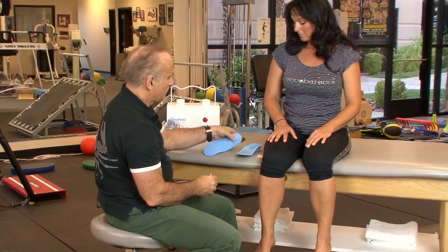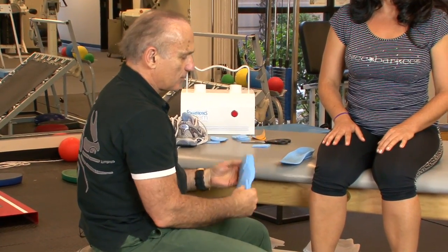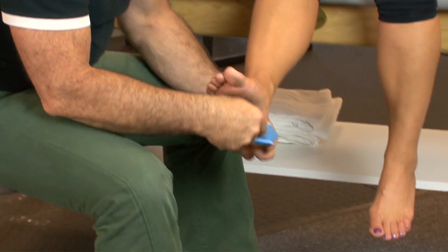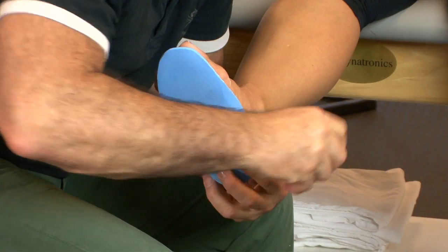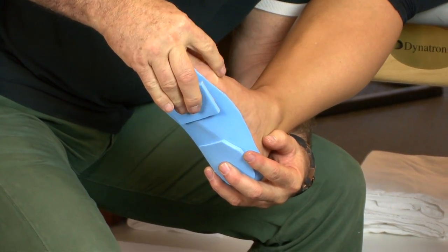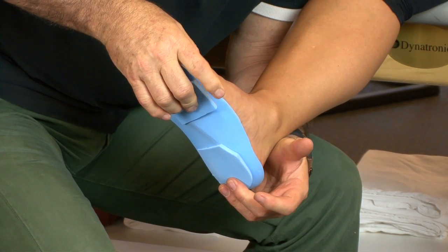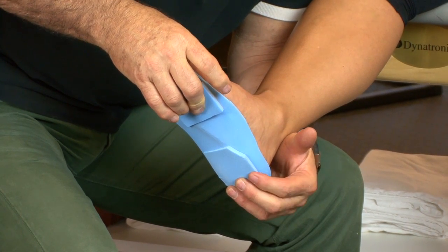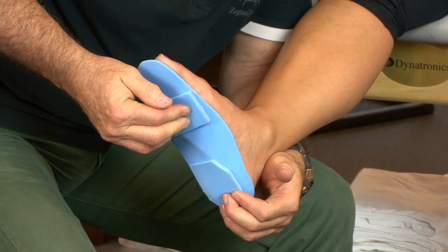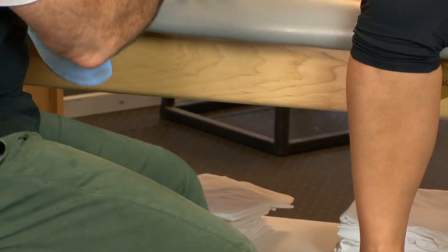I want to do a varus wedge in the forefoot — a medial post — just like the rear foot. I want it positioned right underneath the metatarsal head. So here's the orthotic: I'll place the post medially at the forefoot right under the metatarsal head. That forefoot varus wedge is going to really control pronation throughout the entire stance phase.